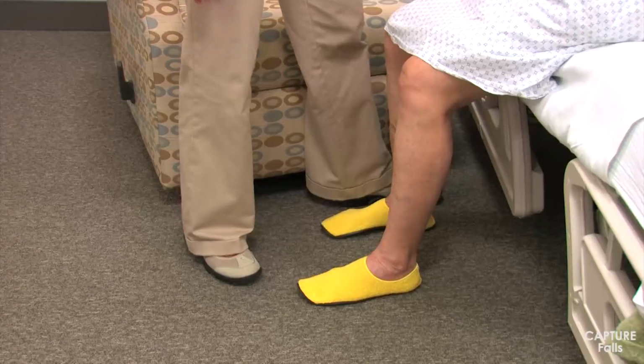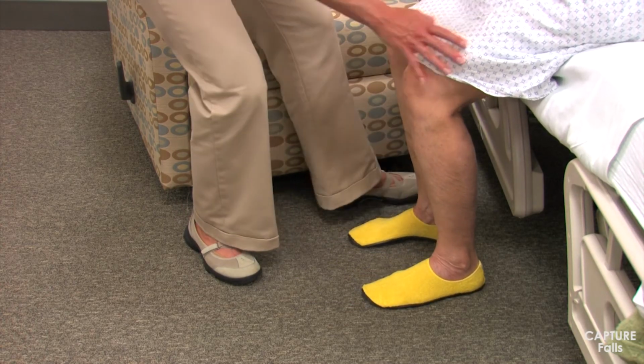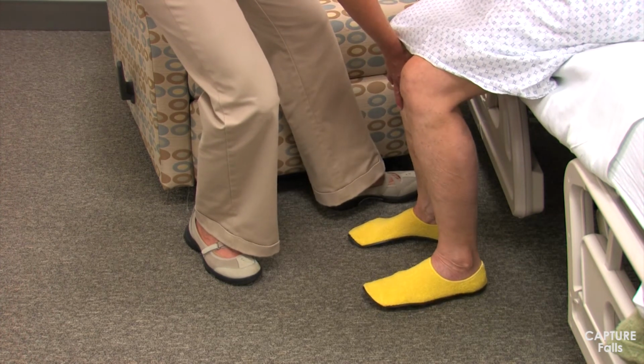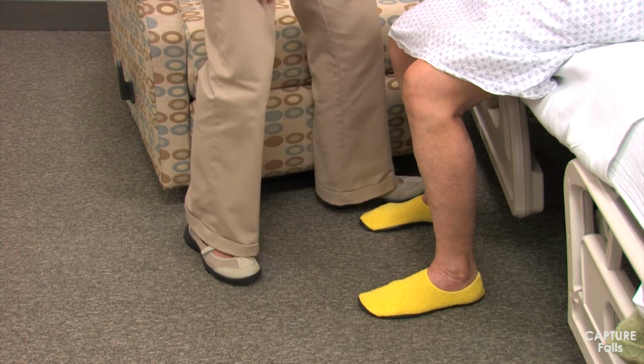This video starts with our patient already sitting at the edge of the bed with the gait belt already in place. Before having the patient stand, make sure her feet are flat on the floor, pulled under her, and are shoulder width apart, so that she has a stable base of support as she comes into standing. You may need to have the patient scoot forward to position her feet appropriately.